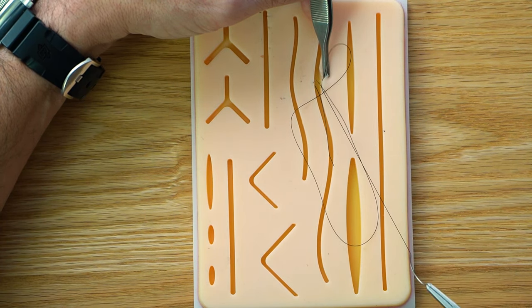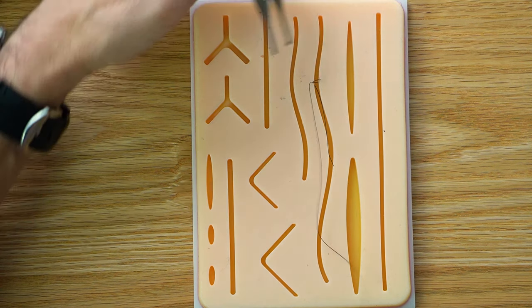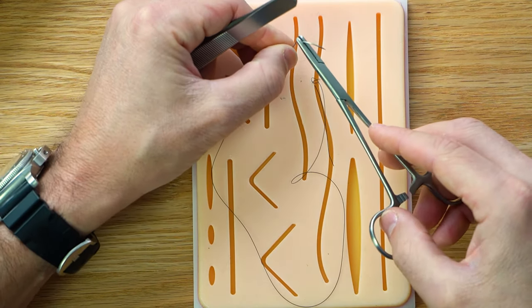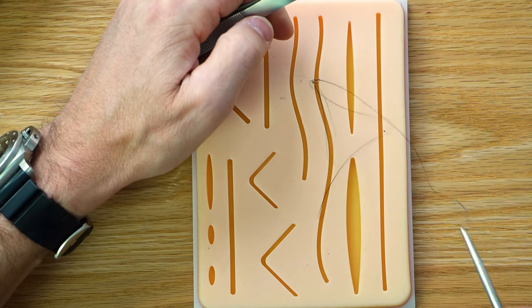Okay, now I'm gonna bring both of them out towards me. And this is gonna be a simple, an interrupted suture. So I got that one actually mixed up because I can't see. So we're gonna go through here, and you know, poor form, don't do that in the OR or whatever.